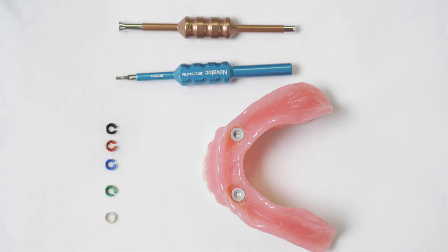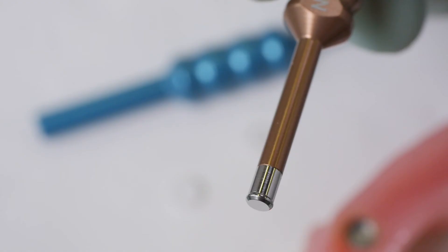It also has some nice tools that allow you to remove a housing or insert more easily. If you need to replace a housing, you have a heating tool — you warm it up, stick it into the existing housing, it heats the housing up, melts the acrylic, and just like that it comes out. That's a major change.